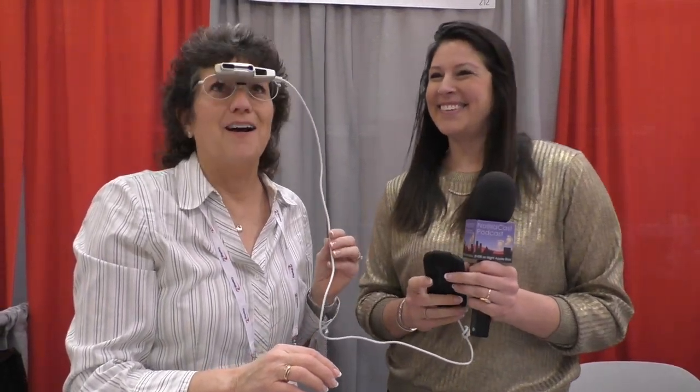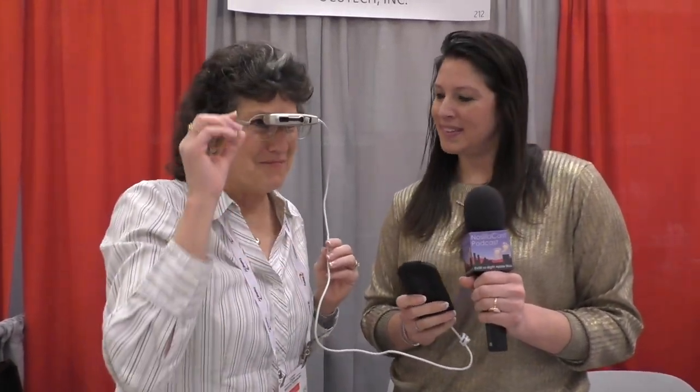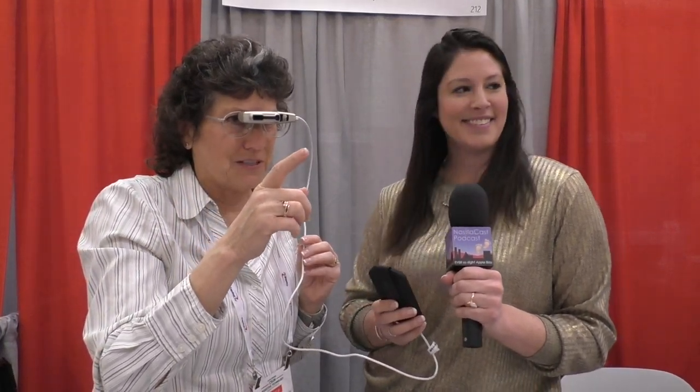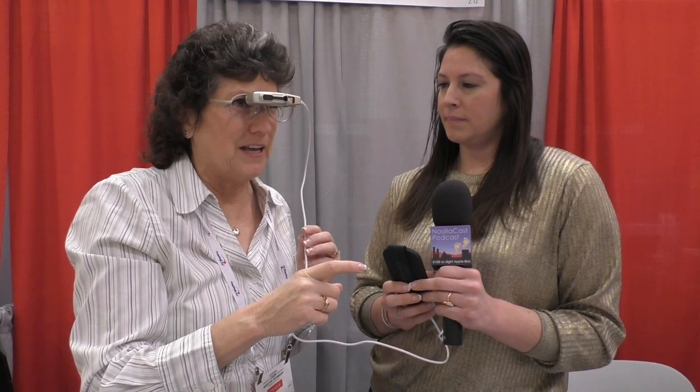I'm looking at my ring, and I'm going to switch and look at Steve. I'm focusing on a sign pretty far away — it kind of comes and goes, but that is tack sharp. That's on my right eye.